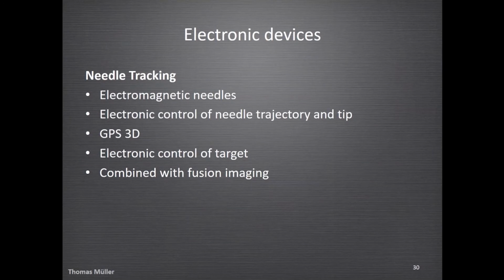And of course, in recent years, electronic devices emerged, and we have electromagnetic needles. There are various kinds of electronic control of needle trajectory and tip. We have GPS systems, electronic controls of target, and we can combine ultrasound biopsy with fusion imaging, for example, to perform biopsies of lesions visible only in MRI or CT.